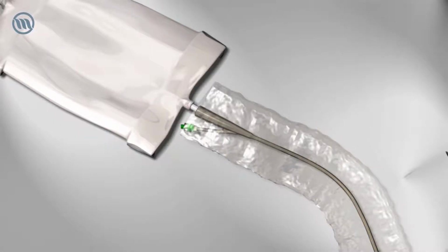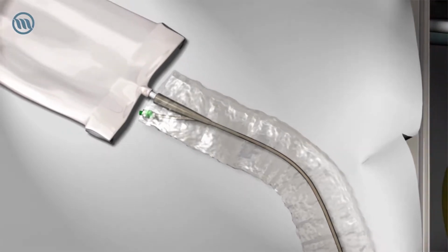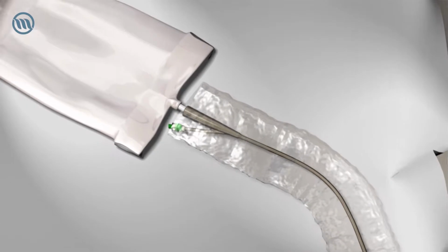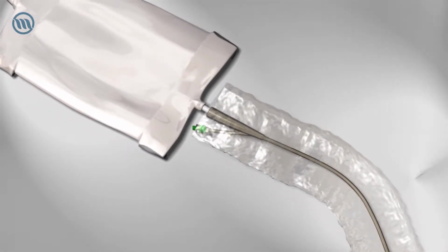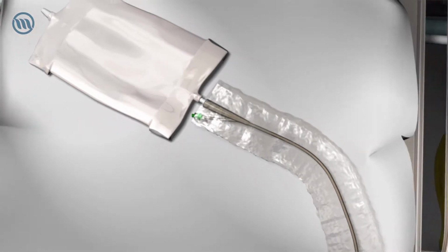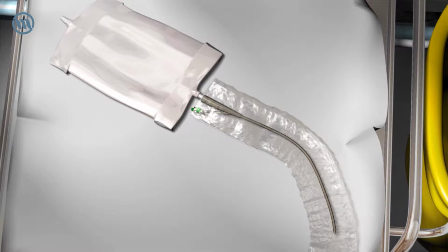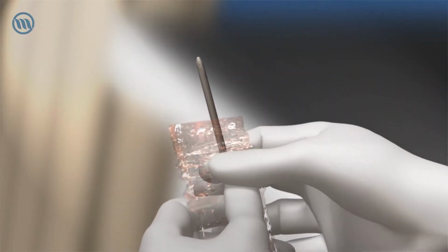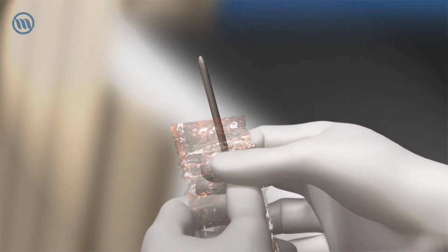Take hold of the catheter in its plastic sleeve and container to collect the urine. A urine drainage bag may be pre-connected to the funnel for convenience if preferred. Place the container on the sterile sheet, taking care you do not contaminate your gloves, and place the funnel end of the catheter in the container. Tear off the plastic sleeve at the tip of the catheter, ensuring the tip remains sterile.